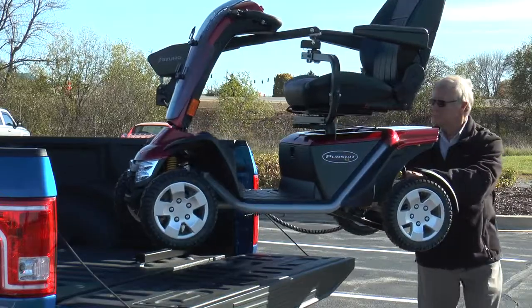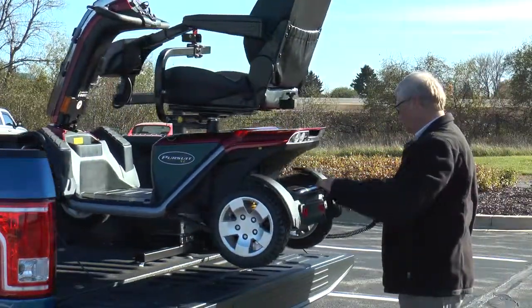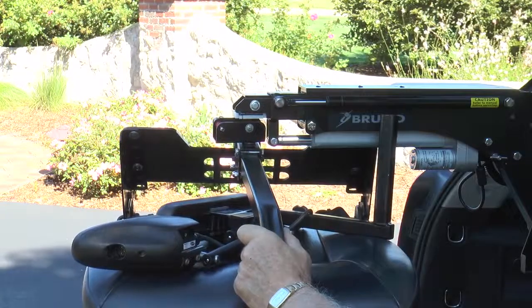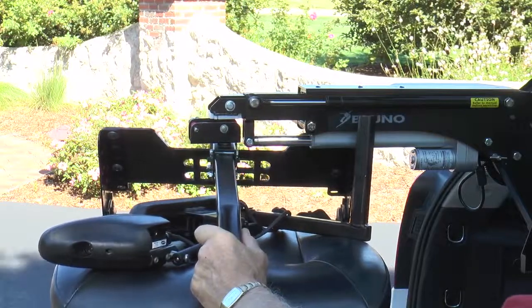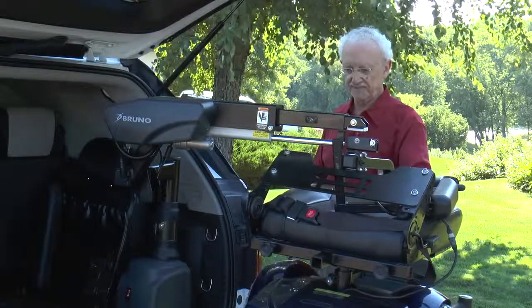A heavy-duty Curbsider is available to lift mobility devices weighing up to 400 pounds or 181 kilograms, and a telescoping lift arm version provides additional extension to help large mobility devices clear bumpers and load in smaller vehicle openings.